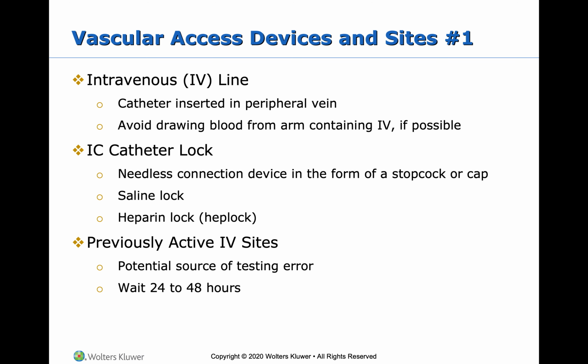Alrighty, so part 2 of chapter 9 lecture. We're going to go over vascular access devices and sites.